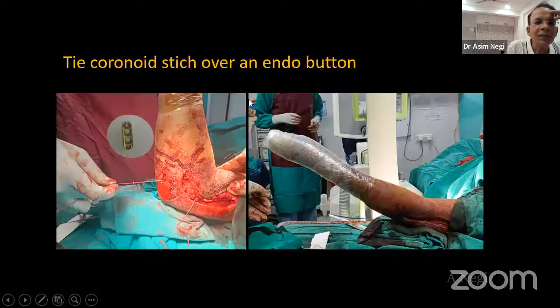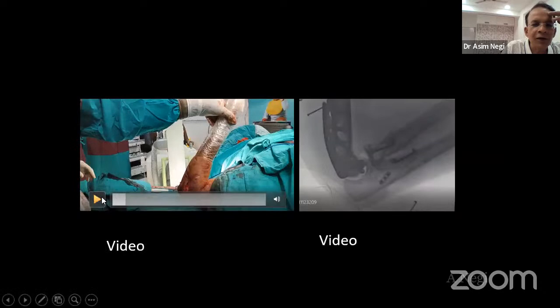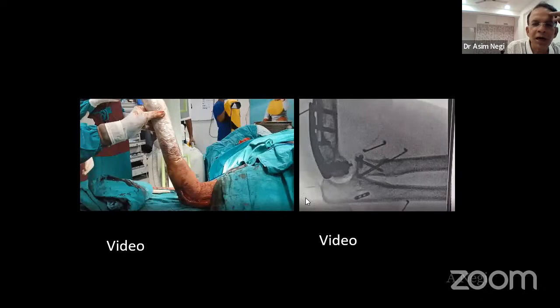So here is the patient. This is the reduction. These are more views. Check the full range of motion. This is the ring, so it should be congruous on table. Up to 30 degree, if it is stable, you don't have to open the medial side.